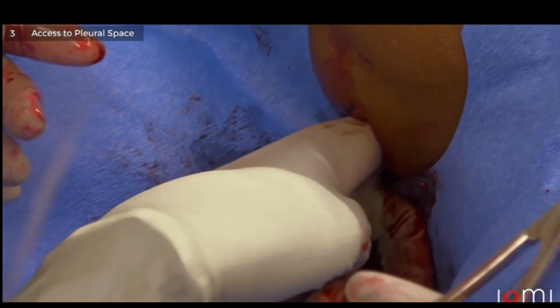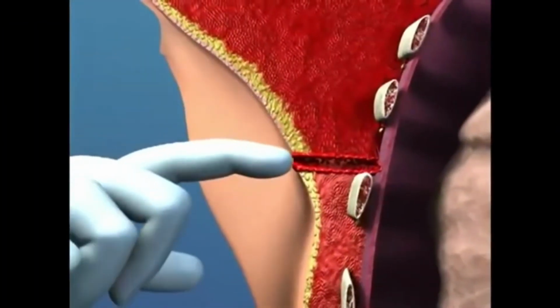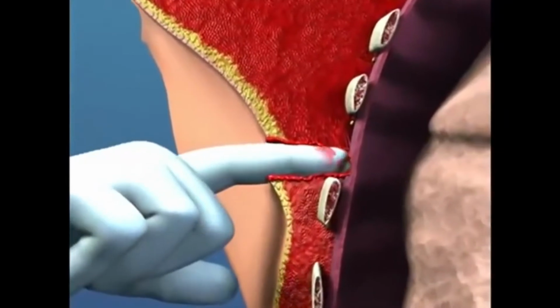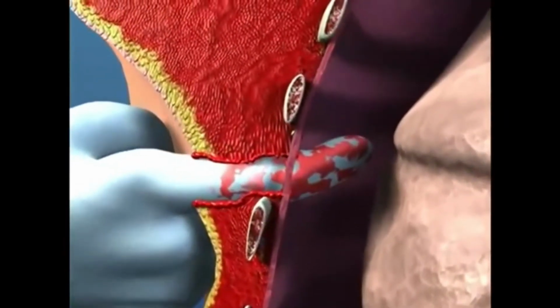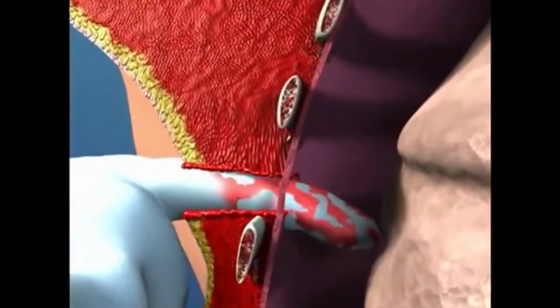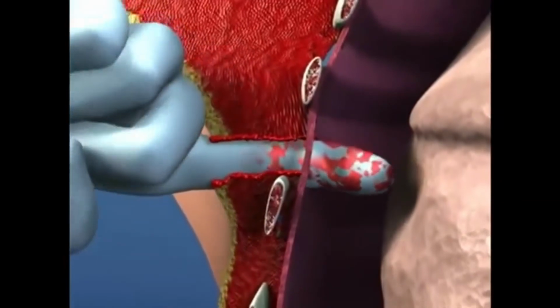Before inserting the chest tube, place your finger into the pleural cavity and move your finger around 360 degrees to confirm the correct location in the pleural space by feeling the lung and making sure there are no adhesions that will get in the way of a successful insertion.